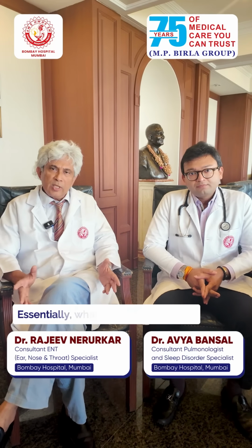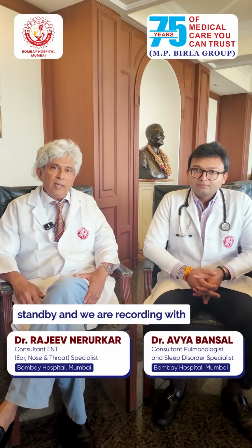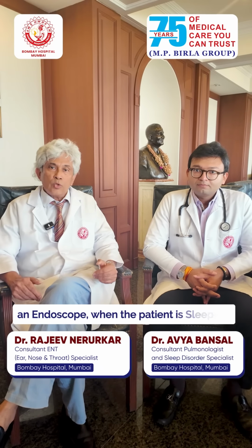Essentially what we are doing is that we are simulating sleep under controlled environment with anesthesia, with the anesthetist standby, with the chest physician pulmonologist standby, and we are recording with an endoscope when the patient is sleeping. We are looking at areas where there is obstruction in the breathing pathway, starting from the nose, the palate, the oral cavity, and the tongue and the epiglottis.